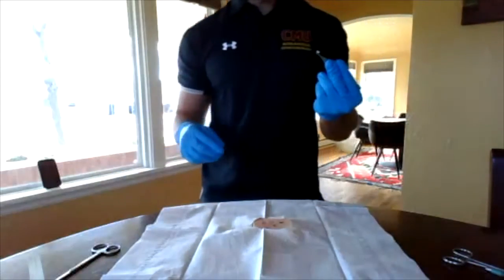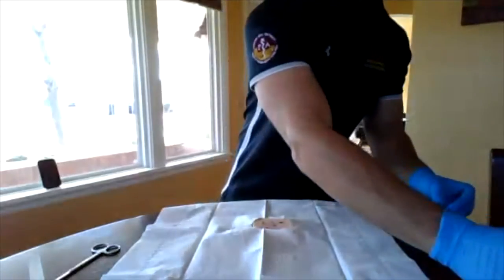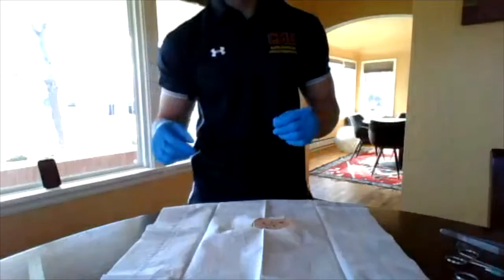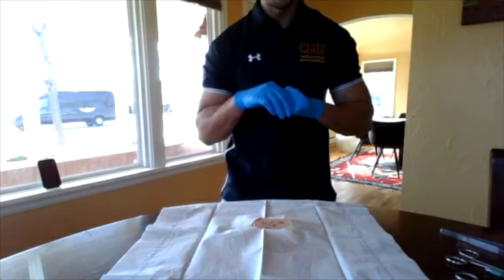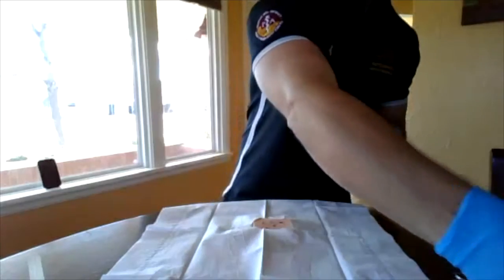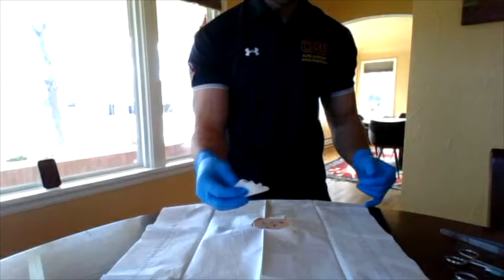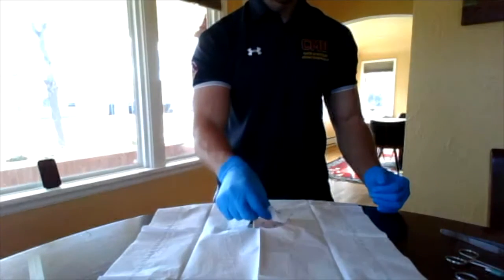Now that you have your biopsy, you'll place it into the container. You'll label it and then ship it off for histology. You'll inform the patient at this point that it may take a few weeks to get back, but you'll contact them with the results. And throughout this procedure, if at any point the patient is bleeding or any drainage is coming from the site, you have a 4x4 gauze and just take care of it as needed.